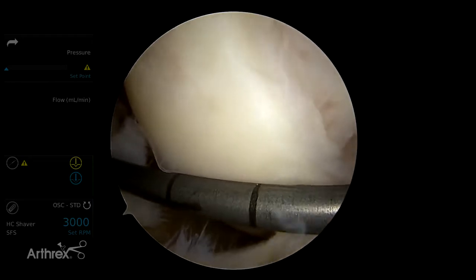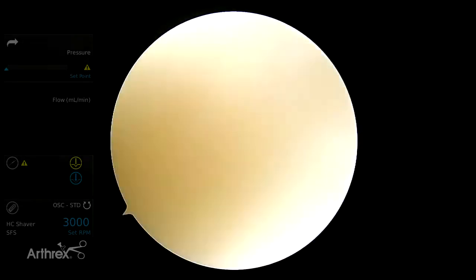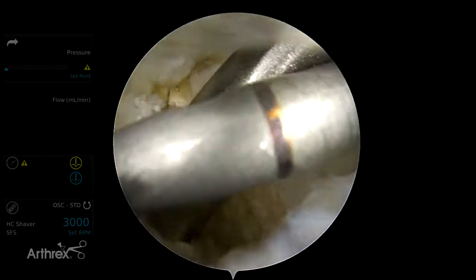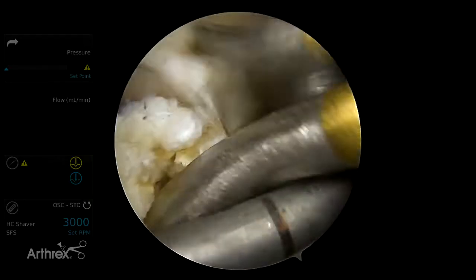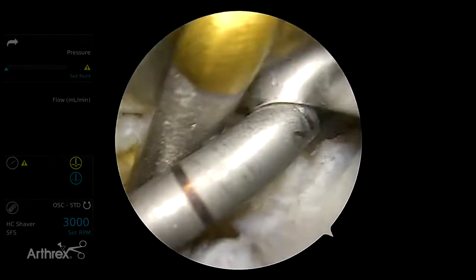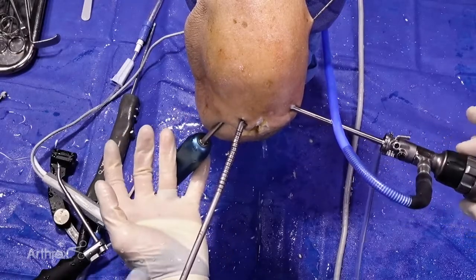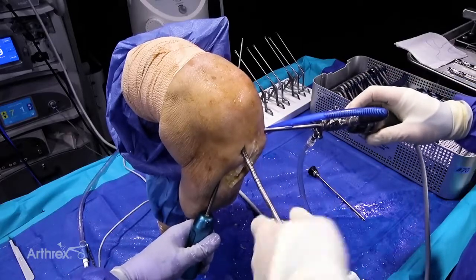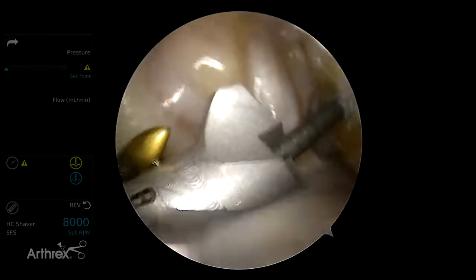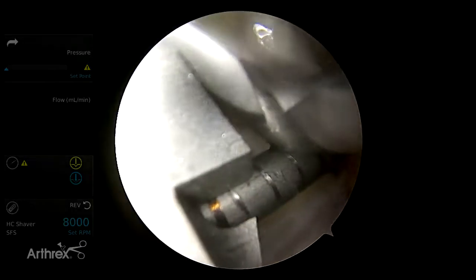You can see the wire coming around the femoral condyle. There is a risk of skiving and injuring the medial femoral condyle cartilage. For this reason, a microfracture pick is brought up through the tibial tunnel and hooked underneath the flexible wire. Because the wire is flexible, it can now be deviated away from the medial femoral condyle — something not allowed by straight reaming systems. With a microfracture pick or other retracting device through the tibial tunnel, the reamer is protected from the medial femoral condyle, and the reamer screws right past the pick into the knee.